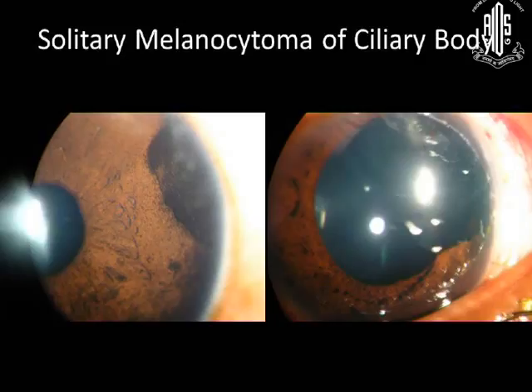But then look at the color. It's blackish in color. Usually melanoma is brownish in color or slate gray in color. So it's blackish in color, and you see these pigment deposits on the surface of the iris. And what we're looking at is a melanocytoma. Melanocytoma does not mean that it has to occur over the optic nerve head. It can occur in the ciliary body and the iris.